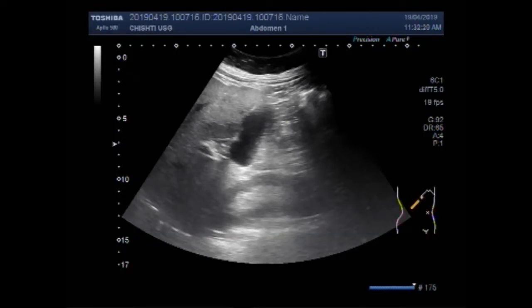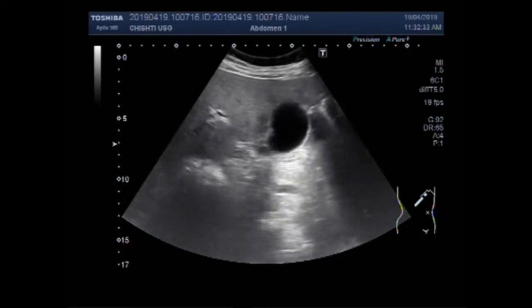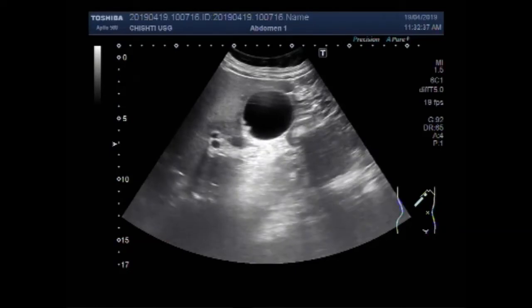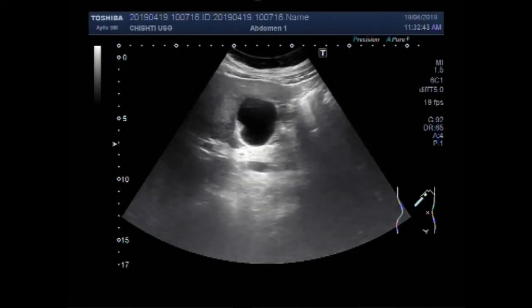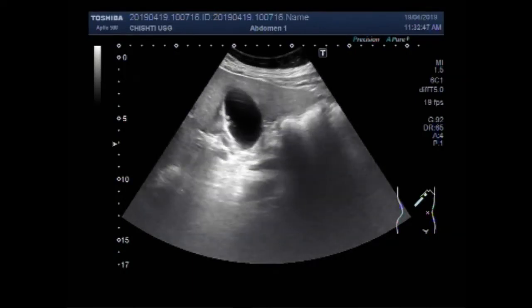Now we put the patient on their side. And now you can see the gallbladder and multiple small polyps — a bunch of multiple small polyps along the interior wall of the gallbladder.